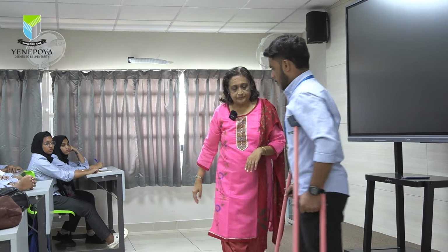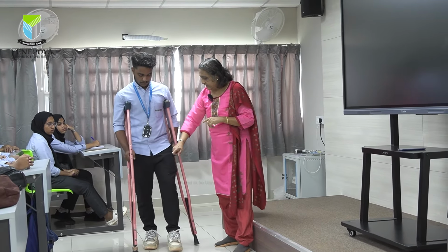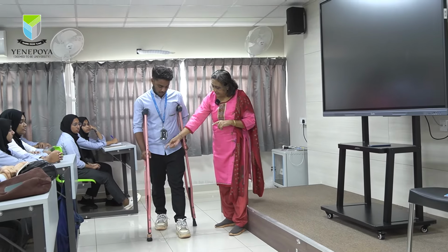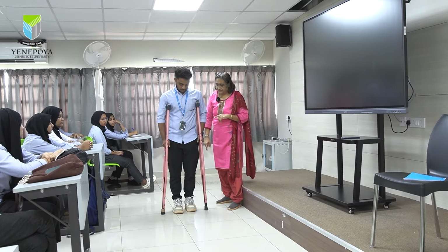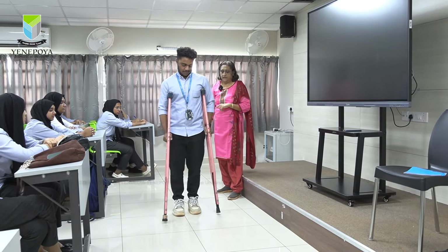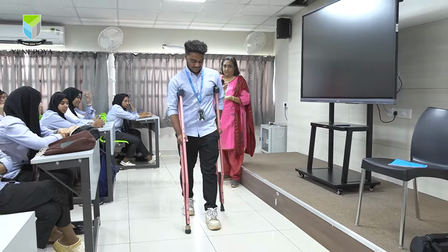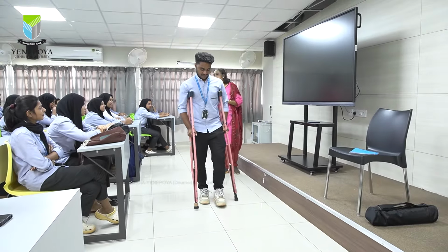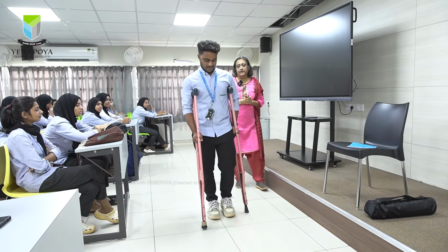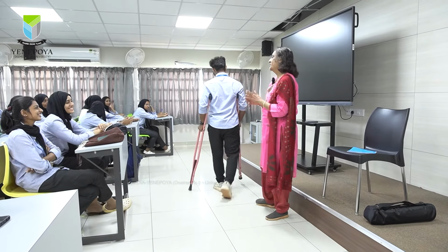Okay, just come here. Whenever you are training, this crutch and this leg go forward, yes, and then that leg and this crutch will come forward. Again, so that is 1 point and that is 2 point. Again 1 point and 2 point, correct. So this is also a type of walking pattern. Thank you. That's good. This is also a type of walking pattern we teach the person.